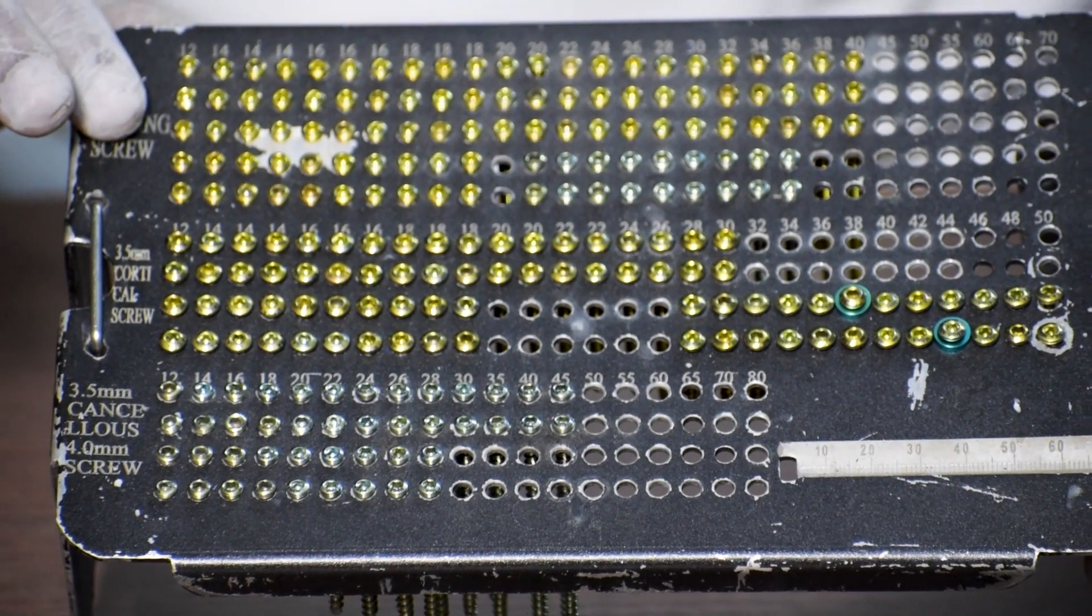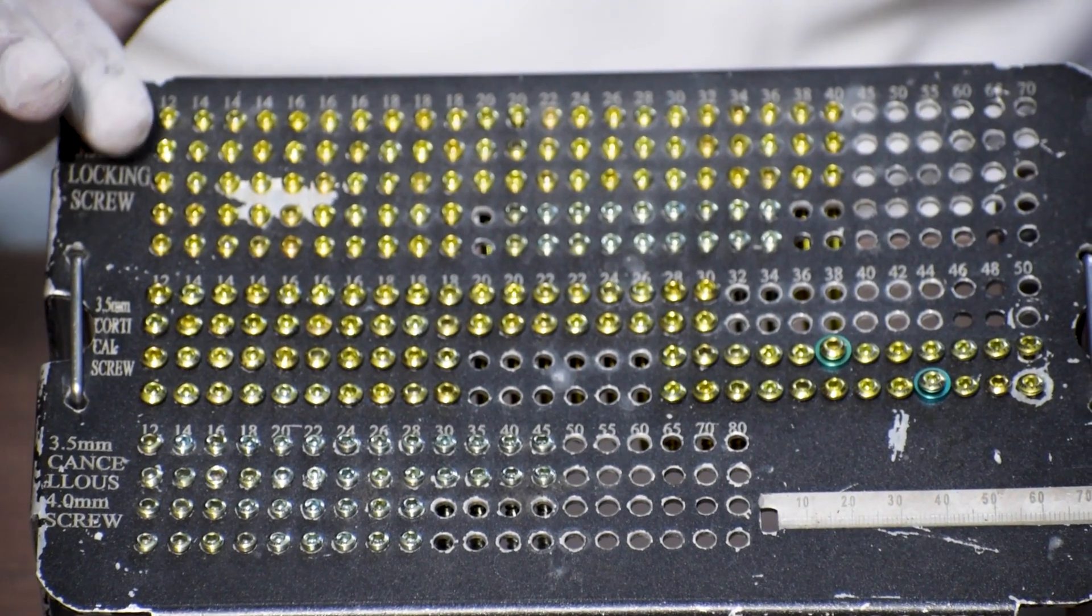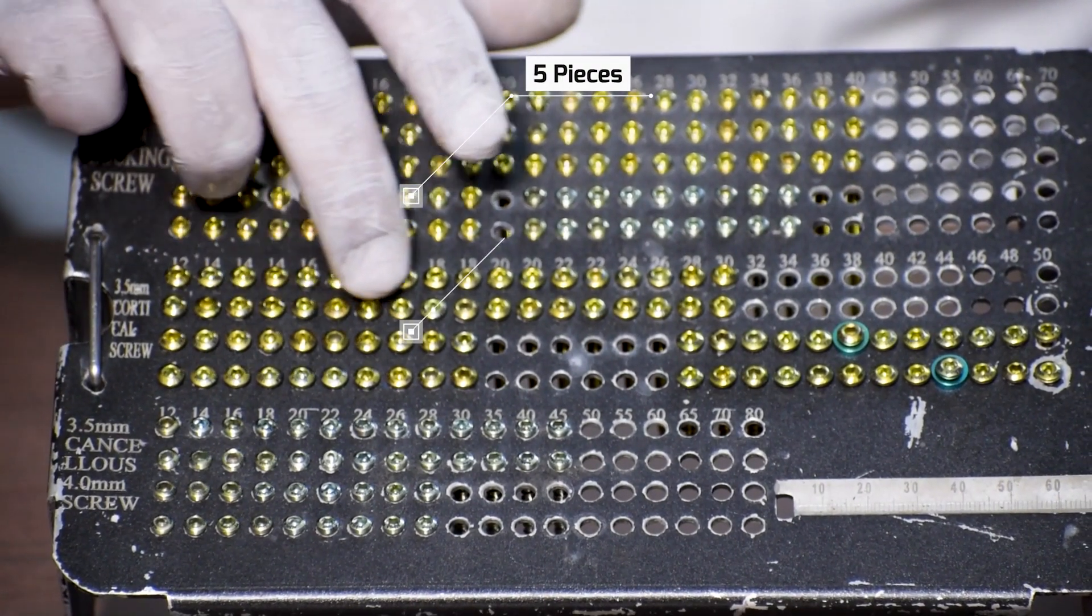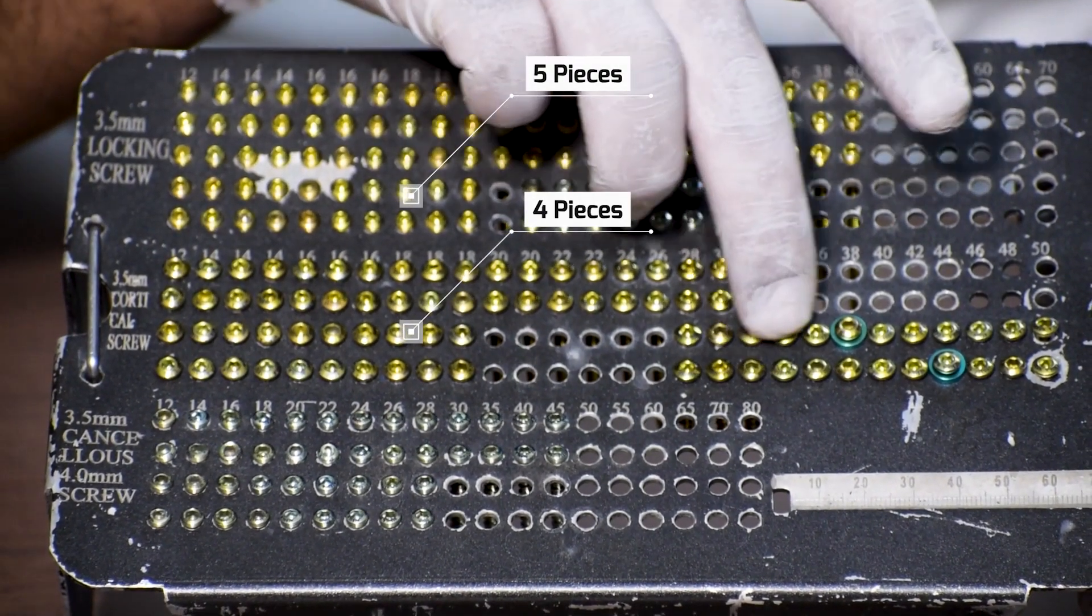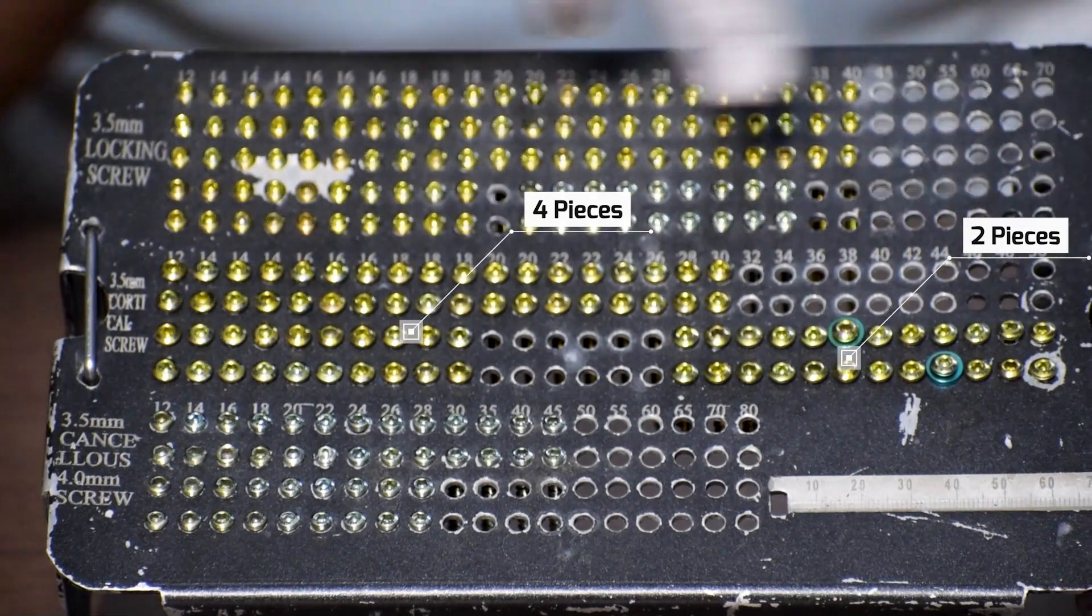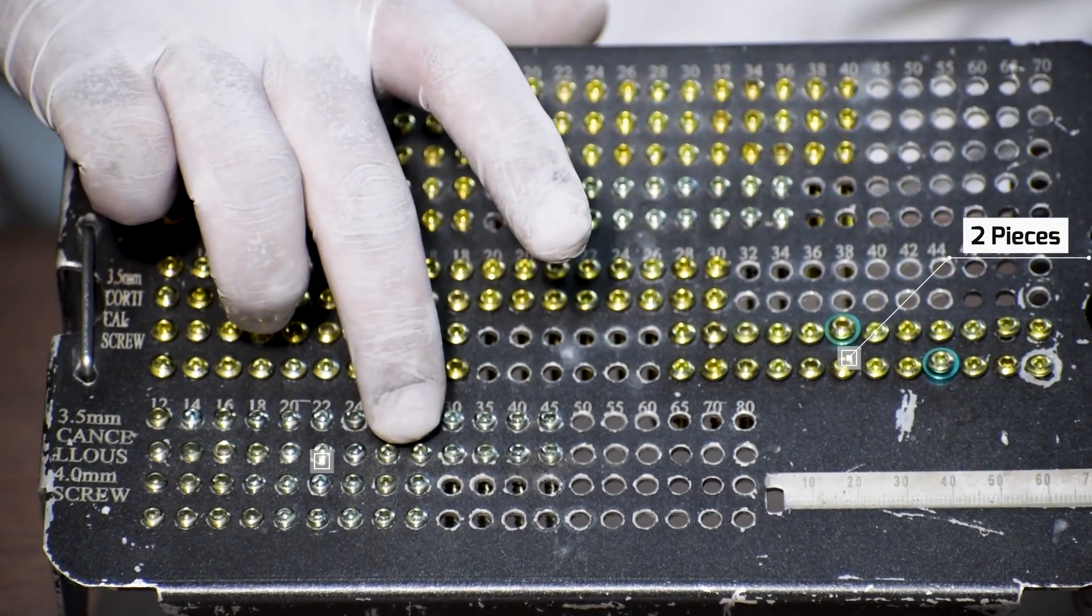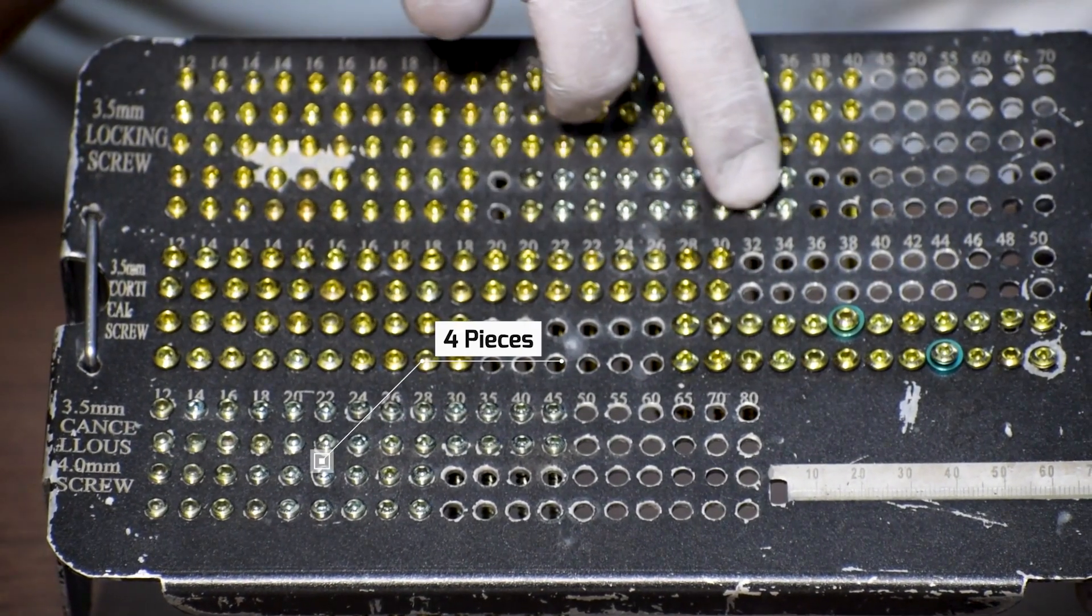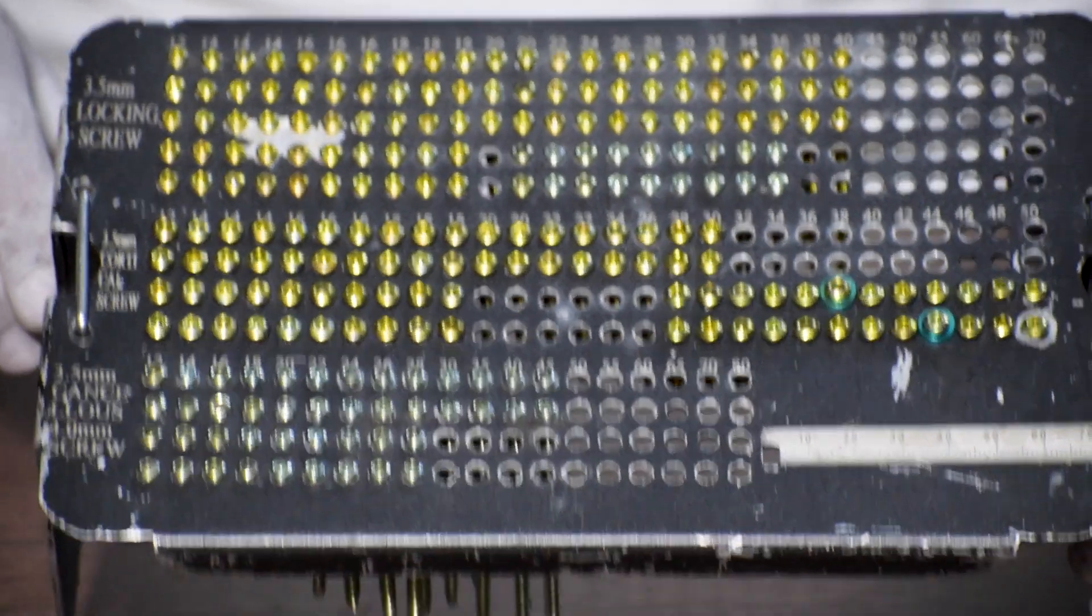As per quantity, generally, 5 pieces of locking cortical screws, 4 pieces of cortical screws, 2 pieces of cancellous full-thread screws, 4 pieces of locking cancellous screws. Here as you can see there are 2 of each sides provided and the rest of the 2 is provided here.